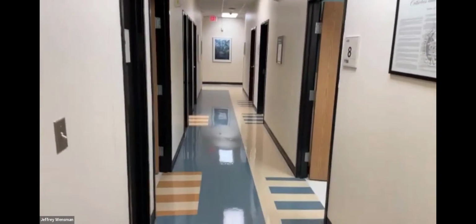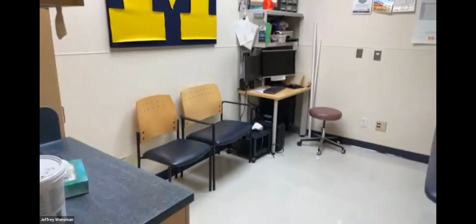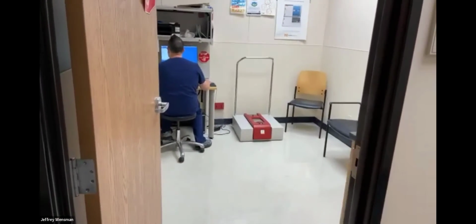And here is our second clinical hallway. And this hallway is a little unique in that it has various ways to digitize. So we have a Willowwood scanner in this room. We have an AmFit scanner in this room. We also have several portable scanners. So we're able to capture patients either in a conventional way with plaster fiberglass or digitally.